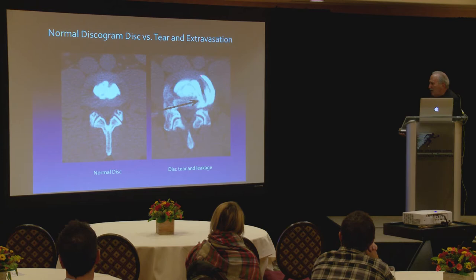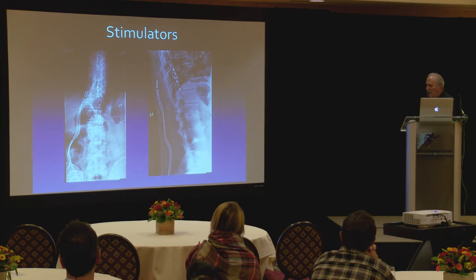You can put in spinal cord stimulators. These are devices that stimulate the cord, not down to the lumbar spine, but stimulate the cord. And these devices, you remember when you're 5 years old and you're riding your bike and you hit your arm against a tree and your arm is throbbing. And so what did you do? You rubbed the heck out of your arm.